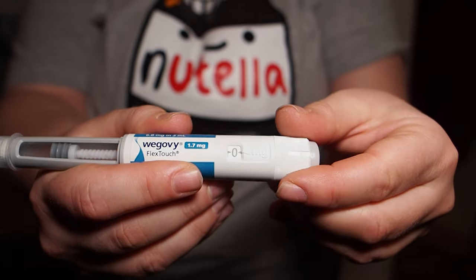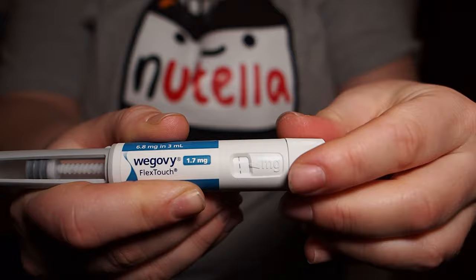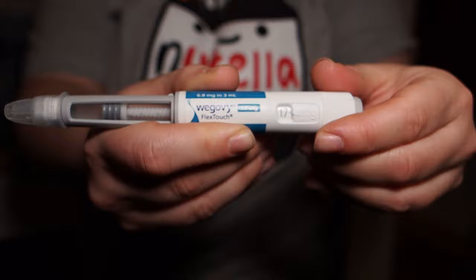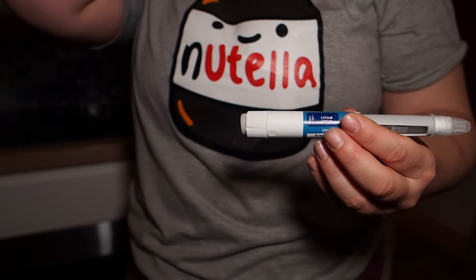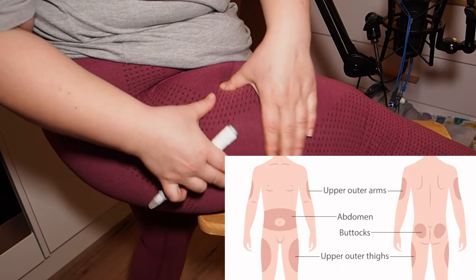Now I'm going to start from zero and turn it all the way so that I get to my required dose. For these pens you have one dose per pen, whereas I know some others have increments you can go up in. Just choose the dose that you are on.